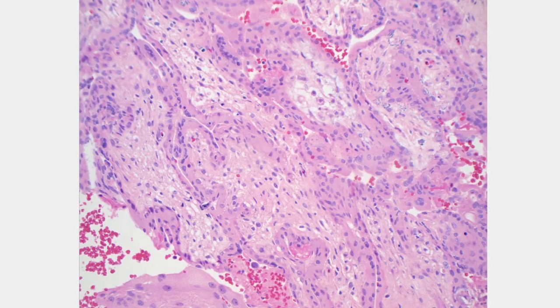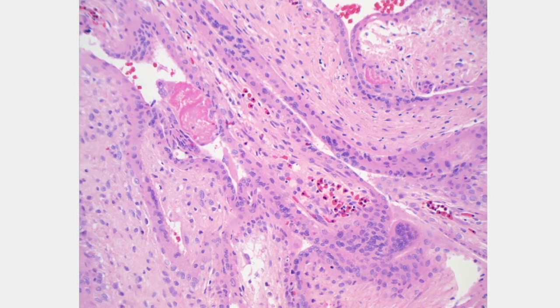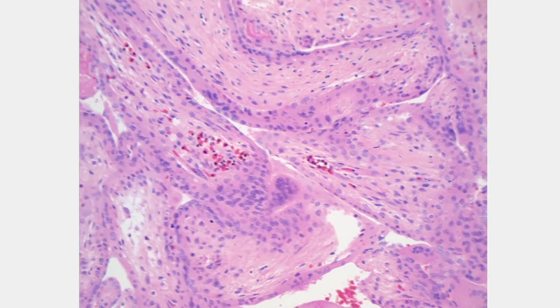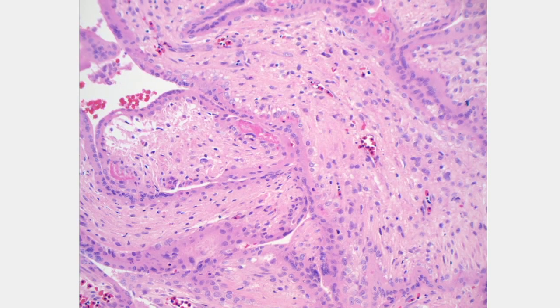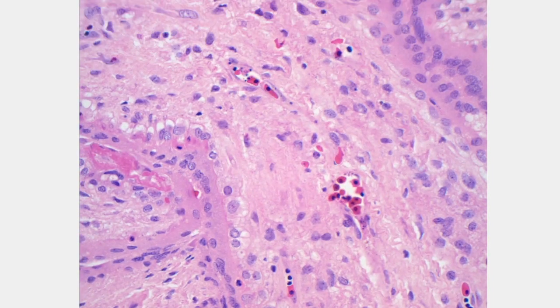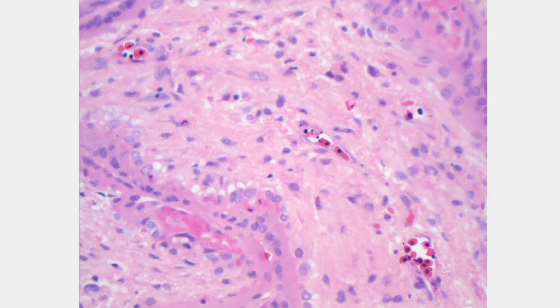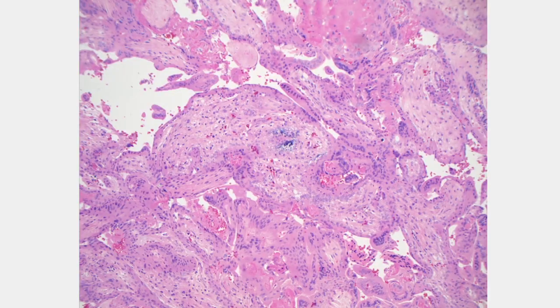That may make you think of an anembryonic pregnancy, for example. But then we start seeing nucleated red blood cells. When you have nucleated red blood cells, it means that there was an embryo. Another thing we're going to see is karyorrhectic debris. You see here how we have some debris, and I think most of those are actually endothelial cells. So that's one example of a missed abortion.